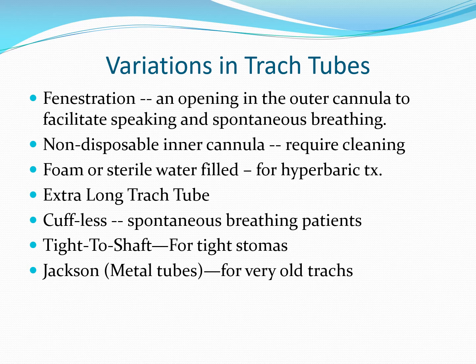particularly in a skilled nursing facility or even some LTACs, long-term acute care facilities, where you'll see a greater prevalence of cuffless. In a home care environment, you'll see a greater prevalence of cuffless tubes. And again, mainly, exclusively actually, for spontaneously breathing patients.